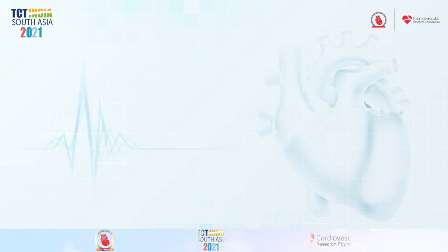Thank you. I think you did a very courageous procedure choosing rotablation, but possibly because you didn't have many other options. So you couldn't do much. And ultimately, I think the result was lucky that you could establish flow. And I think your perforated balloon technique really worked. It's something like a perfusion catheter. And now because they have gone out of the market, we have to deploy these homemade remedies.